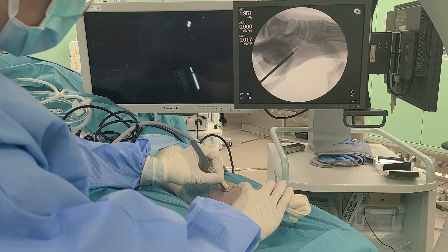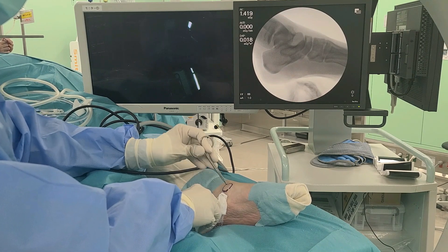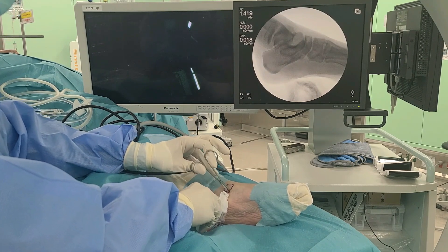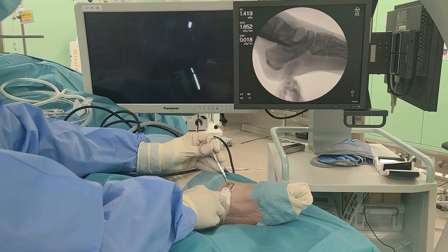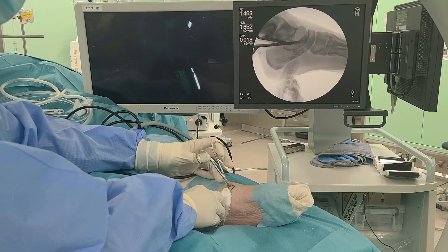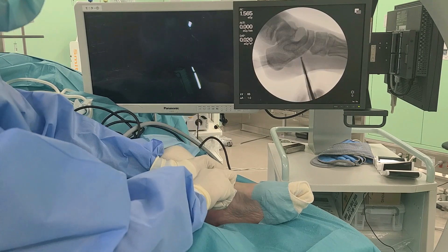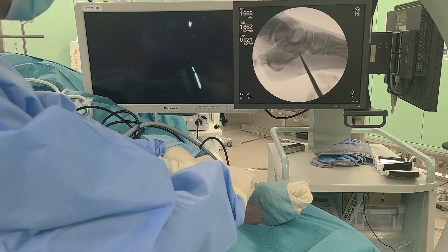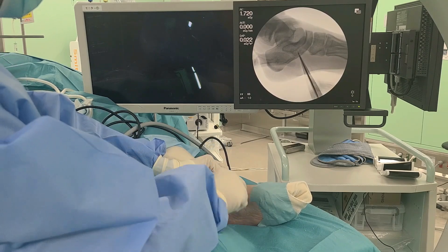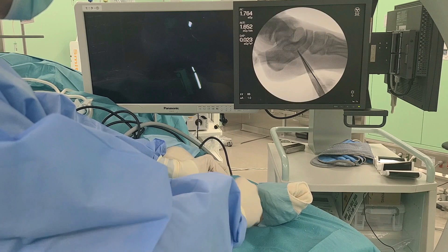5 mm skin incisions are made at the marks, and blunt dissection is performed to reach the synchondrosis. A small curette is introduced through the portal and advanced into the synchondrosis. The curette is twisted to destabilize the synchondrosis.